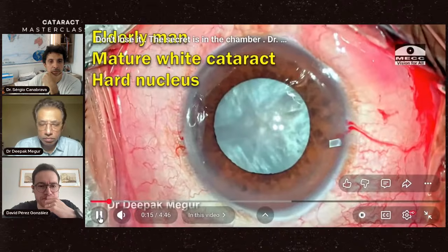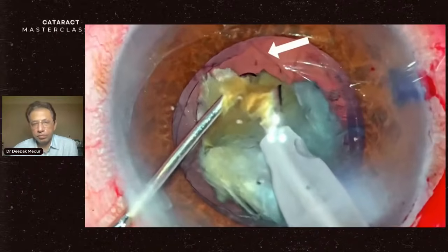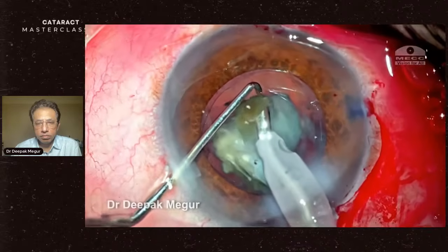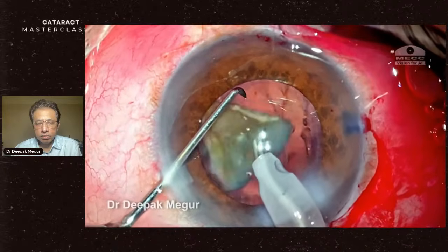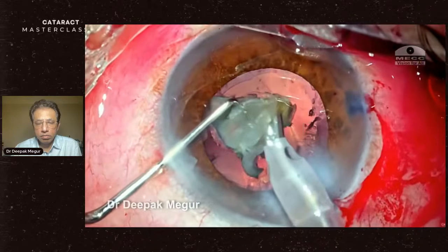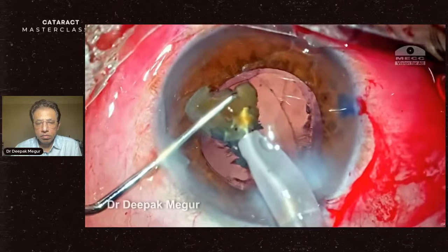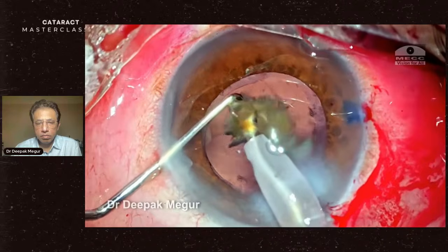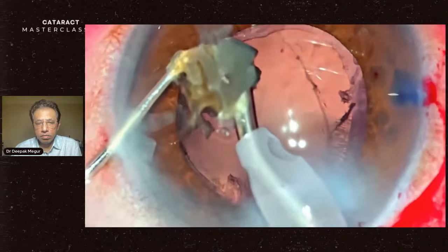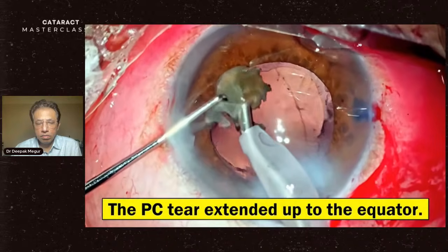And this is a mature white cataract with a hard nucleus. The last two pieces are to be emulsified. There's a faint line visible posterior to the fragment, and this was suspicious. Now I'm left with just the last piece, but the underlying PC tear is staring at me. In my head, I'm thinking I can emulsify this nucleus and there's no need to come out. At the same time, I'm trying to understand the morphology of the tear. The edge of the tear on my left seems to have irregular edges, while the right edge has a straight border. But both ends of the tear look to have extended up to the equator.